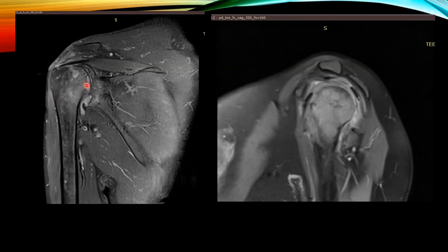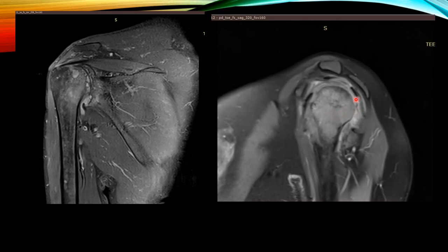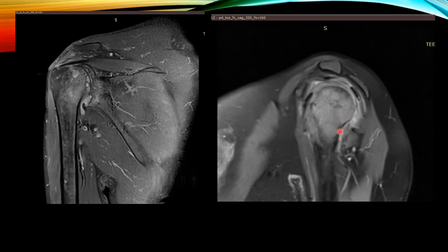This T1 weighted fat-sat image shows a thickened joint capsule with synovial hypertrophy, enhancing areas of marrow edema, enhancing areas of erosion, and a few subchondral cysts. This proton density weighted image shows a homogeneously hyperintense collection along the medial aspect of the head of humerus with secondary destructive changes, multiple cortical erosions, and cortical irregularities, with extension of collection into the left glenoid cavity completely involving the left shoulder joint space, extending into the superior subscapular recess. A few bony fragments are seen inferior to the humeral head, suggestive of infective etiology, likely tubercular in nature. This is a case of inflammatory arthritis.